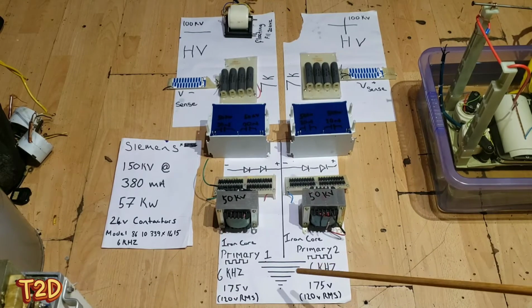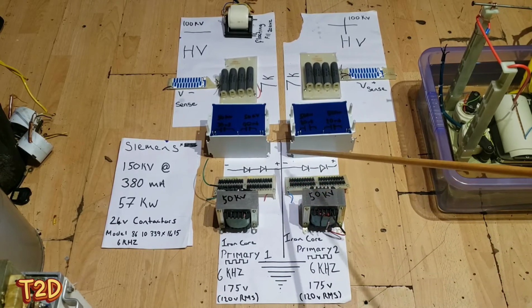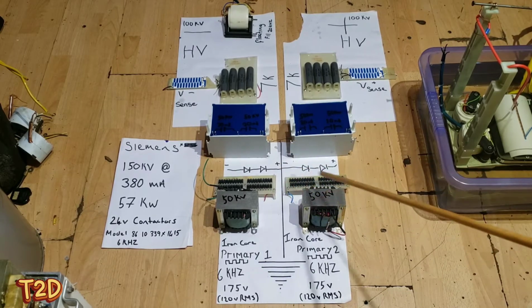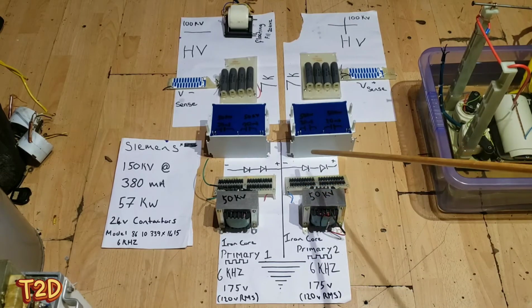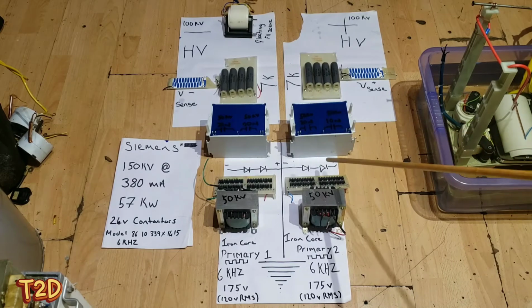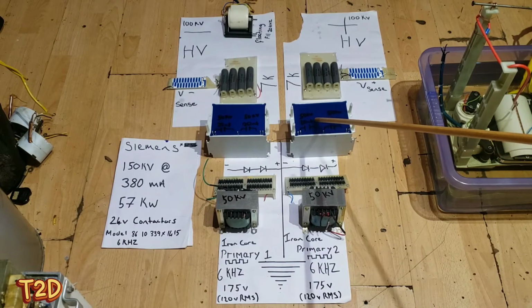So guys, as you can see, there's two transformers in these, because this is a bipolar supply, and they are referenced to a centre ground, as you can see here. So what we have is two transformers, iron core transformers by the way, and these feed into a voltage doubler on each side, comprising this capacitor and these diodes. There's two capacitors in each of these, and they're 20 nanofarads, and I'm guessing 50 kV.